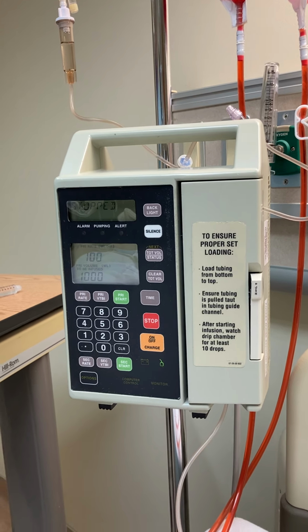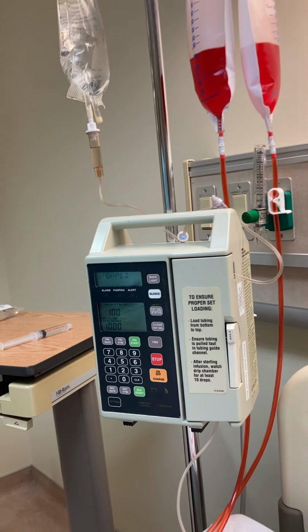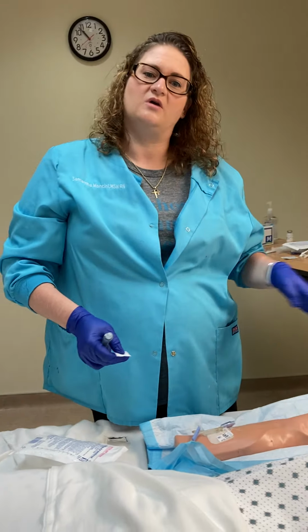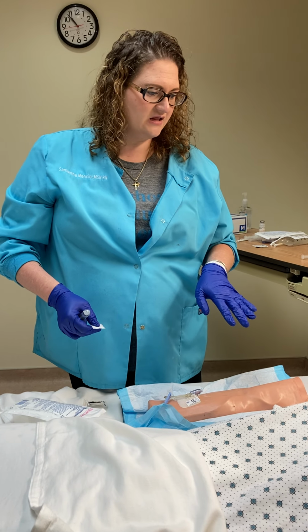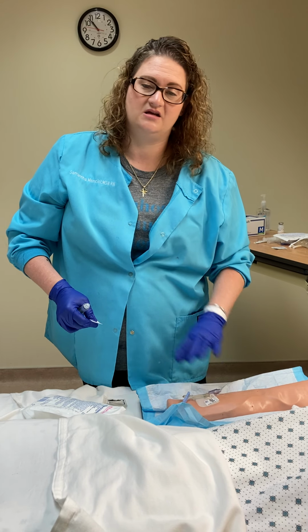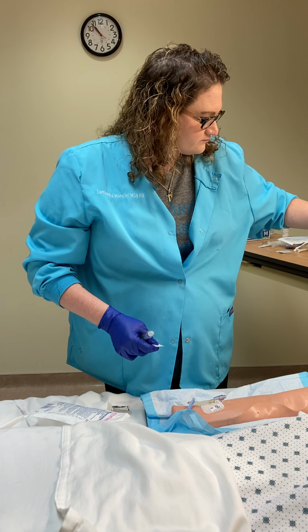My flush. So I, of course, got his identifiers. I had my order. I have my pump set up, identified whether there's any allergies. I assessed my site, and I don't notice any redness, swelling, phlebitis, infiltration.